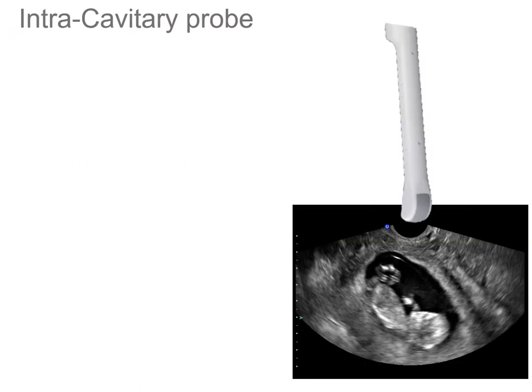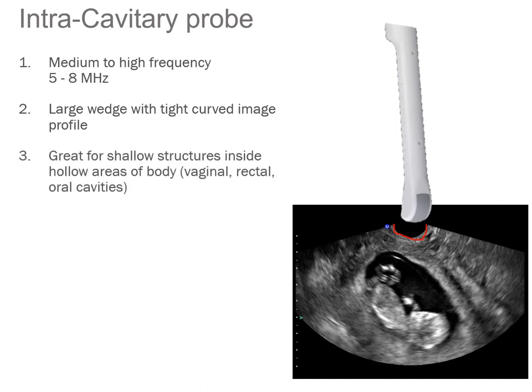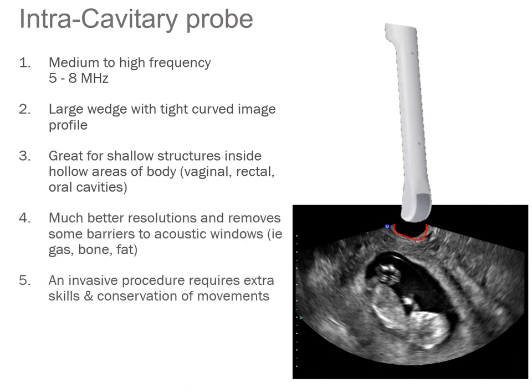And the final one, which we won't, of course, be using in the field at all, is the intracavitary probe, or sometimes known as a transvaginal probe. However, in a pinch, if this is the only thing you've got, you could use this almost like a linear probe. It has a medium frequency, but it has a very tight wedge, and it looks like there's a half a moon taken out of the top of it. But it's good for shallow structures, which is why it's an invasive use of this particular probe, but gives you good pictures and good resolution. So we won't focus on this particular one, as it tends not to come in any of the portable handheld machines.